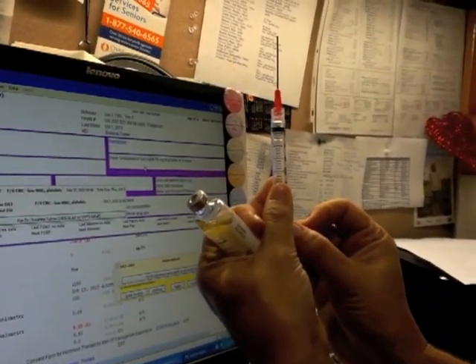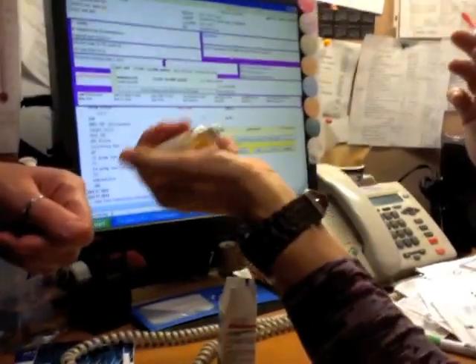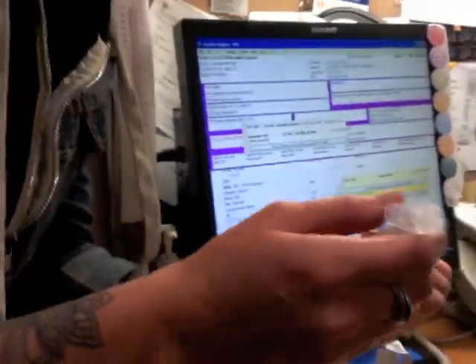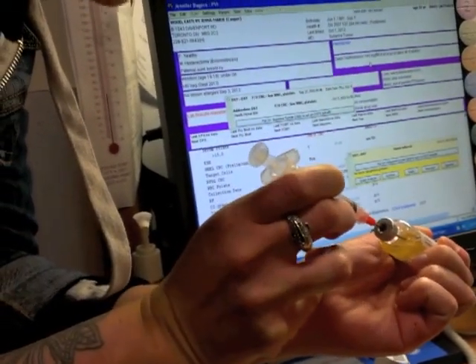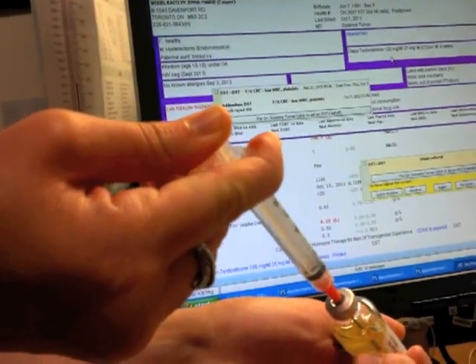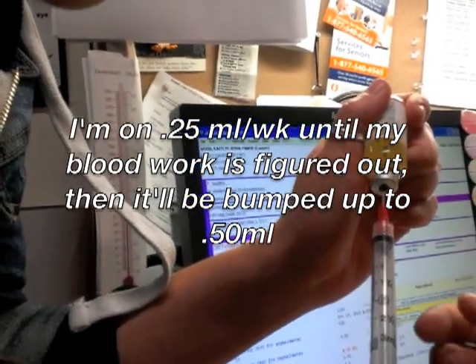So you're going to inject the air into here. What I usually do to keep it nice and steady is just to kind of cradle it in my hand, and then with this hand inject it in. Cradle and inject. So you're not going to poke yourself. You just always want a baseline. So now you're going to inject the air. And now you're going to flip it upside down like that. And you're going to make sure the tip of the needle is in the solution. And you're going to withdraw.